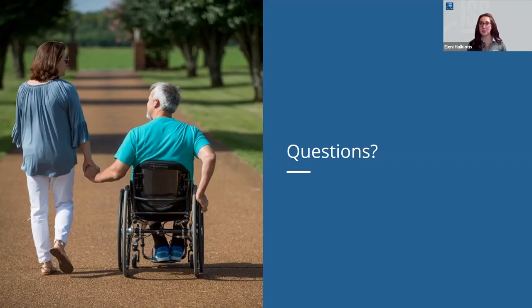Yeah, I'd also say, good is better, or better is good. Sometimes we have all these things that we want to be able to do with our client, and maybe they can only tolerate so much change with this new system. And it might be that we implement a few of those changes with this system, and then maybe the next chair, they are ready to do a lot more, or even the next year, they come back and they say, you know what, I'm sitting in the chair more, I'm ready, you can get more aggressive with this back, we can even switch the back out, things like that.